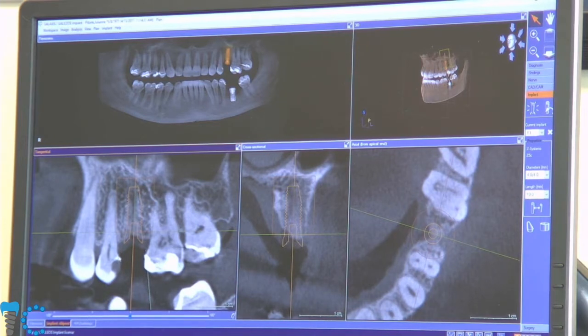And this is so that long term, the bone between our implant and the adjacent tooth, or the adjacent implant, is stable, so that we don't progressively lose bone height. Because in our treatment planning, we're not just trying to treatment plan what the crown's going to look like the day of delivery, but we're trying to treatment plan what is this crown going to look like 10 years from now. Is it going to have bone loss around it? Are we going to impact food? Are we going to impact the health of the adjacent teeth? So we're doing long-term crown down treatment planning.